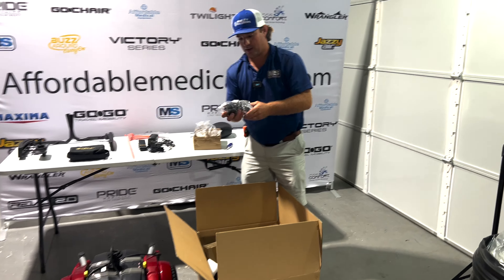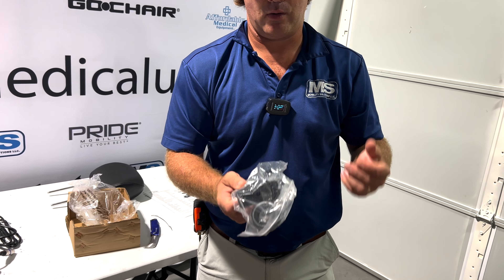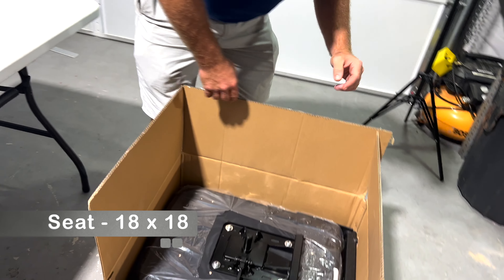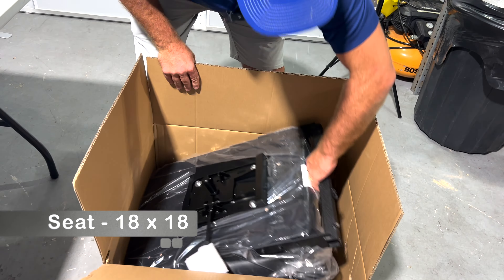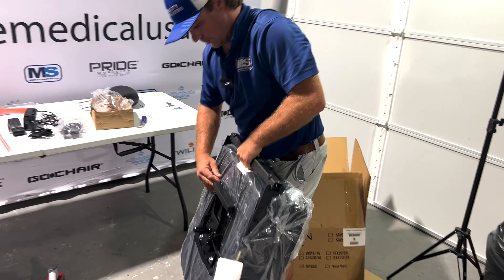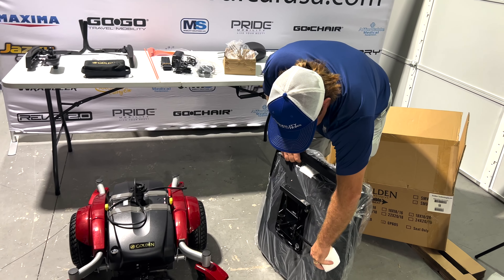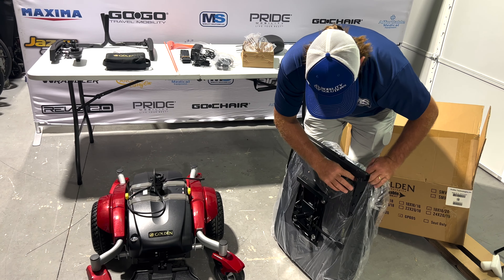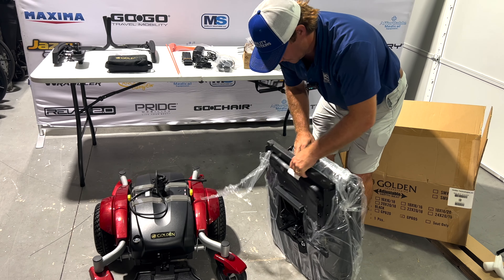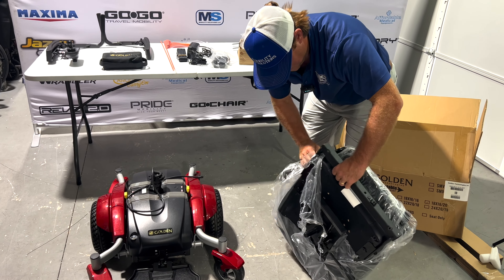This is going to be your receiver for the back. You are going to have to bolt this on if you're going to be using an oxygen tank holder or some different things. Here's your seat — this is the 18 by 18. There's four different types of seats. You can change the depth of these seats. If you're left-handed, you can get the swivel part of it moved to the left — just let us know. We can order it that way or before we ship it out, we can change it over for you.